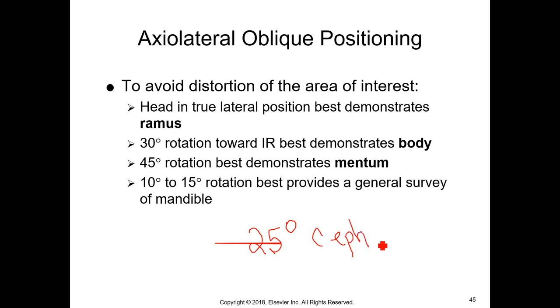This is really hard, guys. This is about what my handwriting looks like, like a kindergartner did it anyway, so close enough. So that's supposed to be a 2. I don't know why it's doing that. It looks kind of bad, but anyway, 20, maybe I'll do it again. 25. There you go. 25. Let me get rid of this. That looks crazy. All right, anyway, 25 degrees cephalic angle.